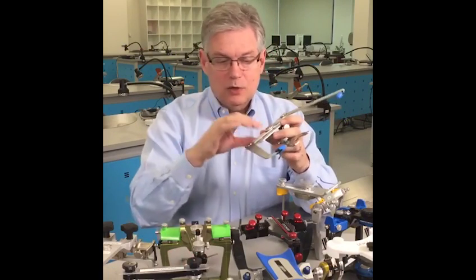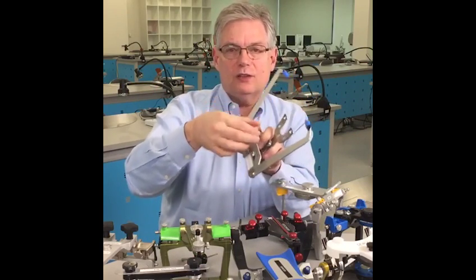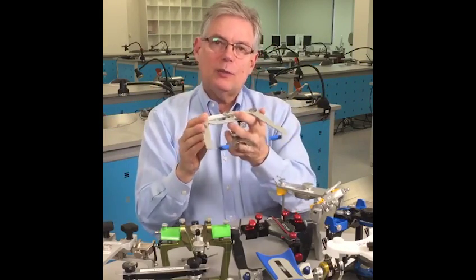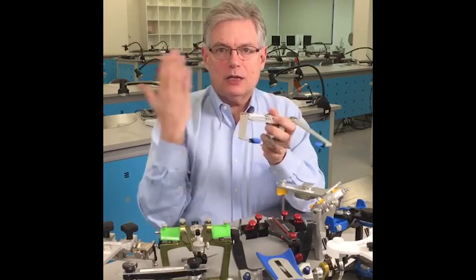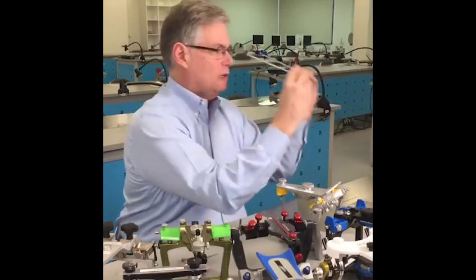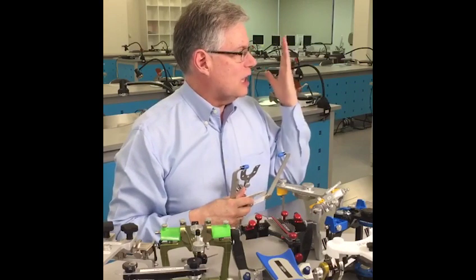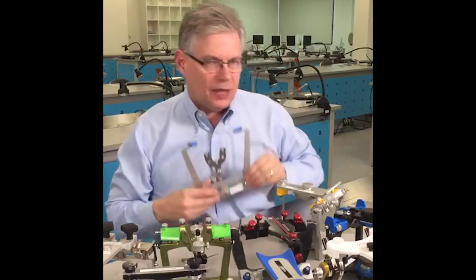And with any system, you can do this. For instance, with a Denar ear bow, it means you would not use the little device that slides in and out from the side to point to infraorbitally — I'm going to give that up. What I'm going to do is have my patient get in position looking at the horizon, and I'm going to look at their face, and I want to make sure they don't tip, because as soon as you put a face bow on somebody's face, they're going to do that because they put weight out there. So you want to look at how they're faced — I'm looking at horizon. That's the same relationship that I want when I'm done with my face bow. I might have to coach my patient to get that.